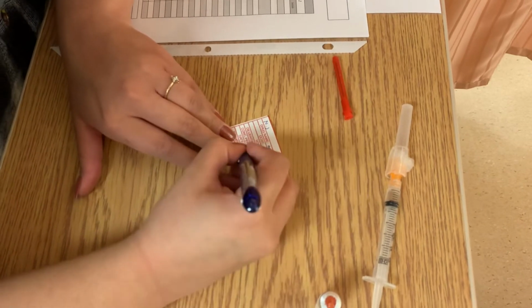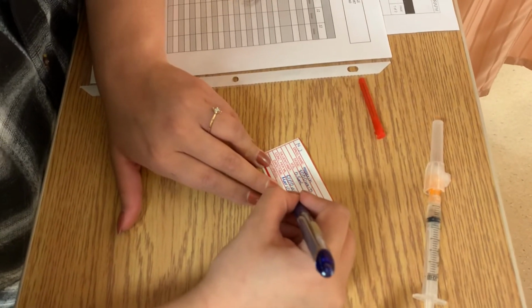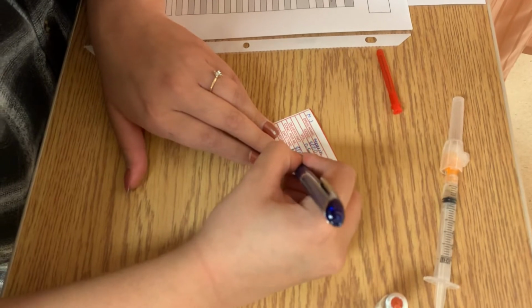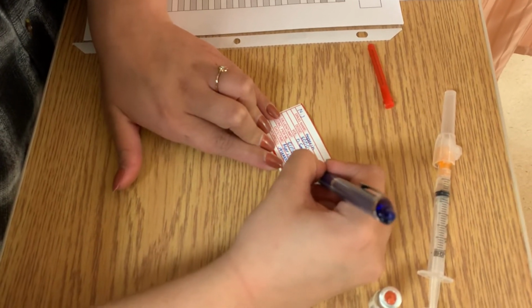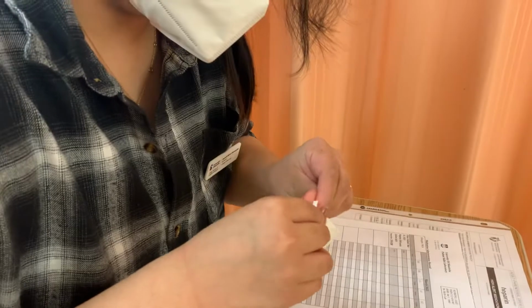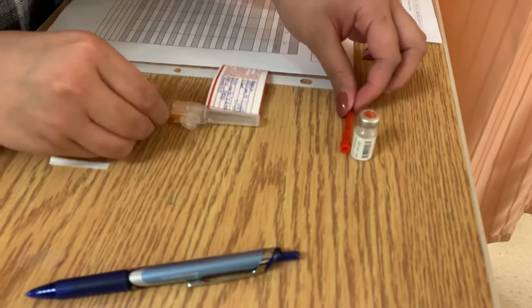The current date and time is March 10, 9 a.m. My signature is JHUMNS2. I'm going to write right here. I'll be writing sub cut to make sure I see that. So now that I have that, I'm just going to pull this out, attach this to my needle. Okay. So while I have that ready, I'm going to do my second check.